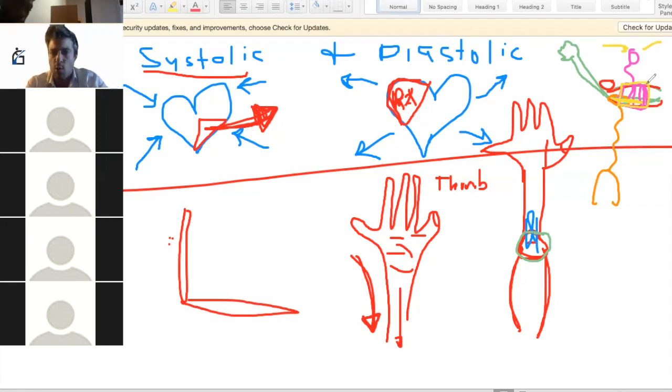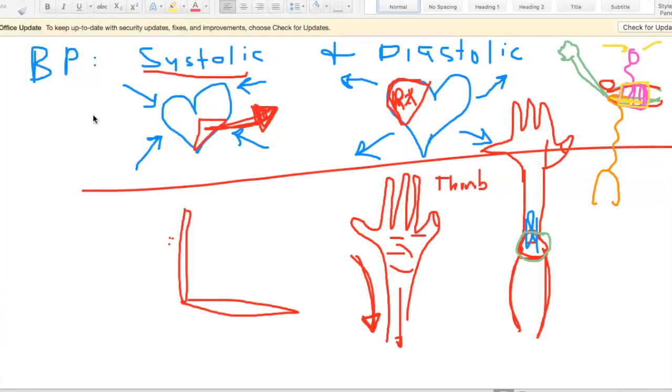So those are the things that are working together. Let me get rid of your eyes and stuff so that I can continue with a clean screen. You have your stethoscope, the thing that looks like this, with the diaphragm that you put on the brachial artery. You have your sphygmomanometer, which is the cuff with the Velcro on this side and that side, and your arrow that goes over the brachial artery. And you have your little tube with the bulb, and on it there's a little button. If I turn it one way and squeeze this little rubber thing, the air fills the cuff. If I screw the little dial the opposite way, the air comes out.